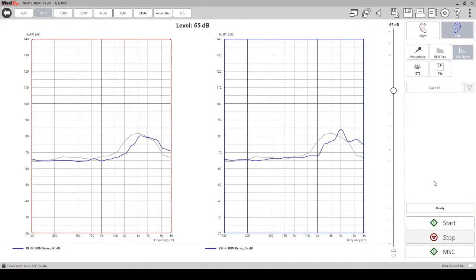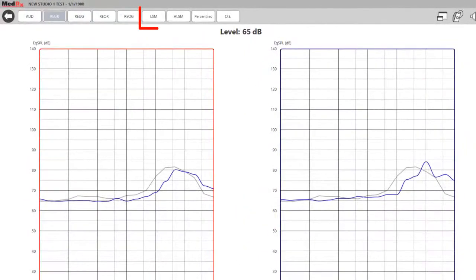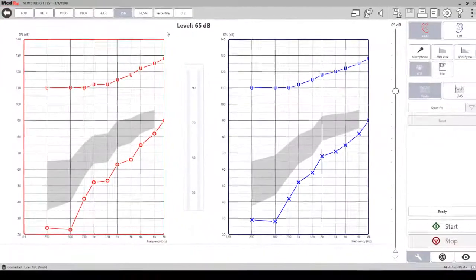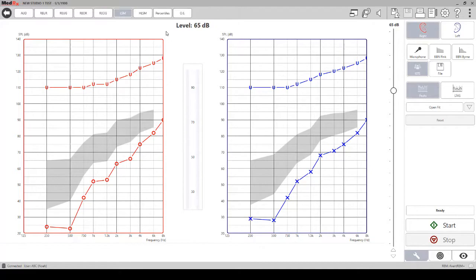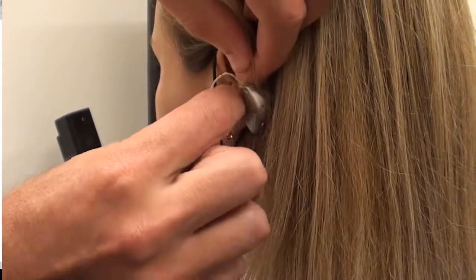To begin the live speech mapping, click on the LSM tab at the top of the screen. Before you begin, place the hearing aids in the REM mode if the hearing aid manufacturer software has the option. Place the hearing aid in the patient's ear along with the probe tube.